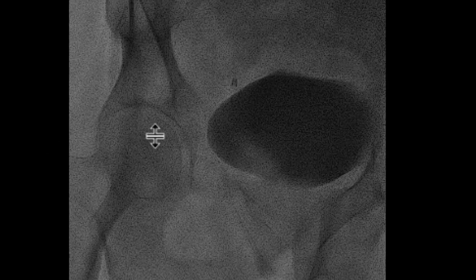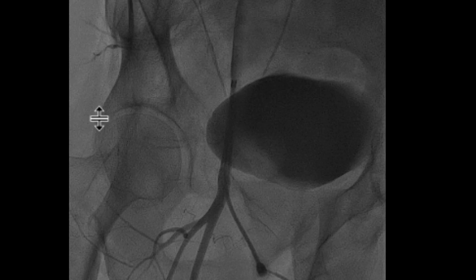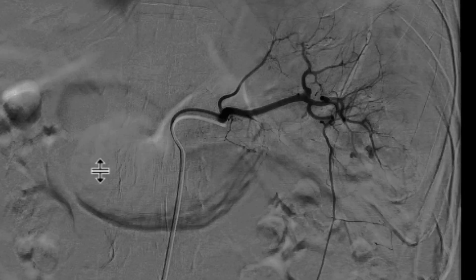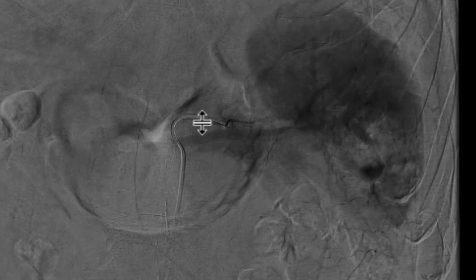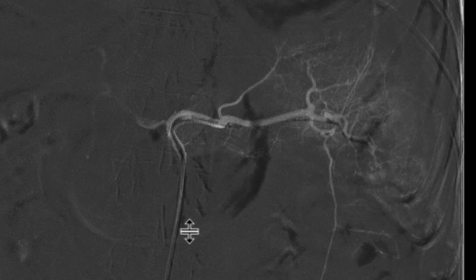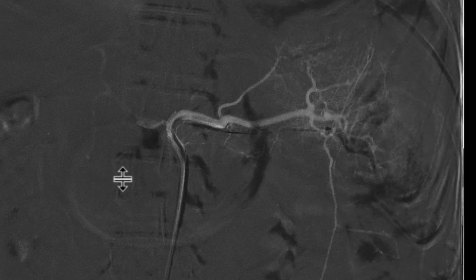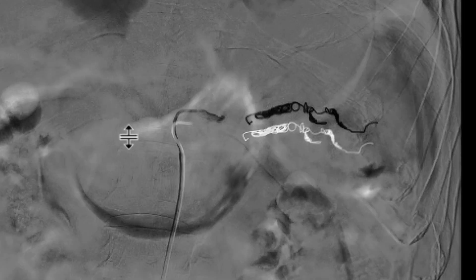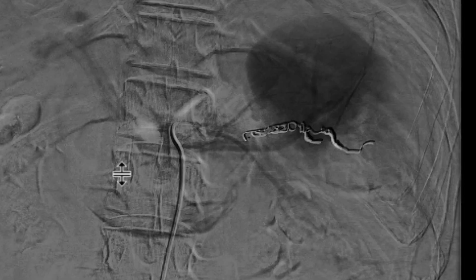The patient was then brought to the interventional radiology suite for further evaluation and potential intervention. As vessels are being selected and the splenic artery is being selected, you can start to see that there's extravasation of that lower pole splenic artery — visible on multiple images. Eventually, this was embolized using coils, as can be seen here, to effectively treat this laceration.